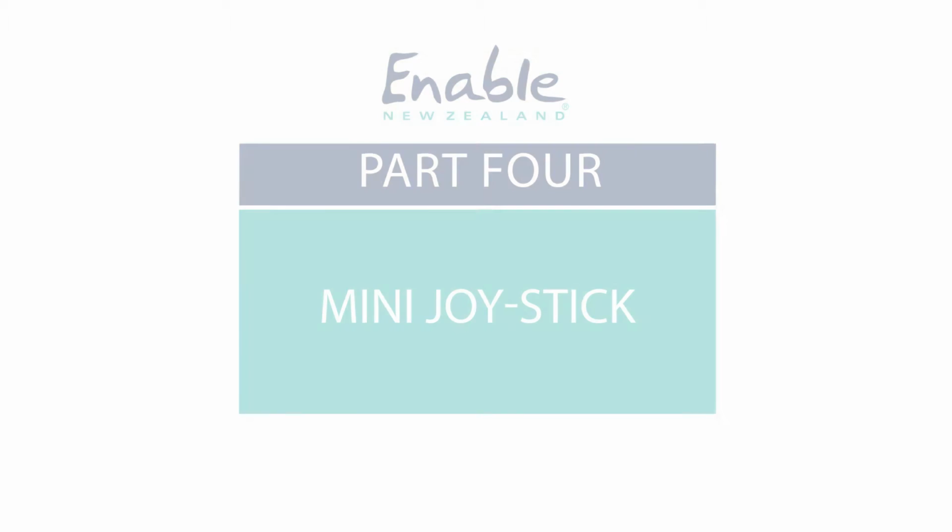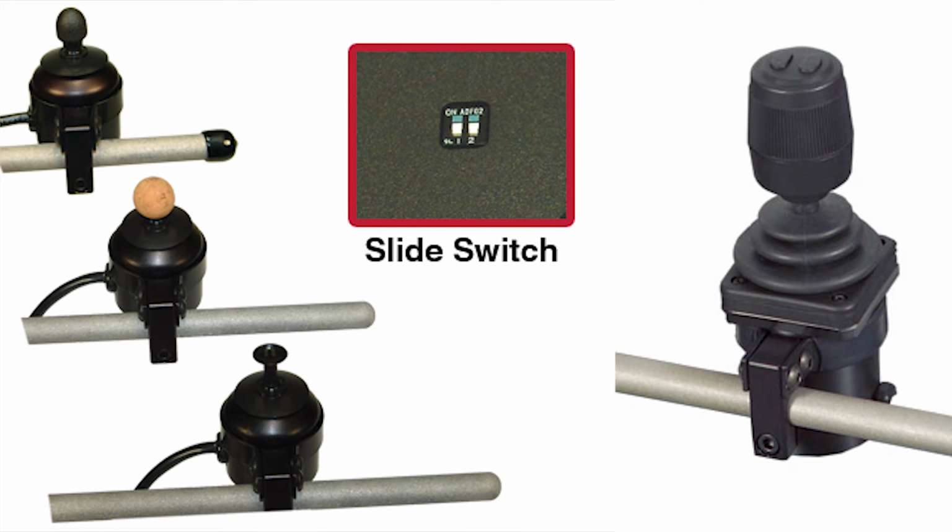Mini joystick, something I think that can be overlooked. And obviously it's a nice option that you don't need a lot of strength or force to move the controller. For those of us who have lots of movement, they can be a bit challenging to drive. But for those who have very little, it can be a nice thing.